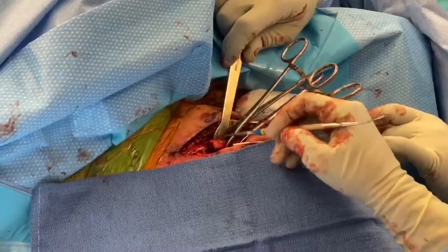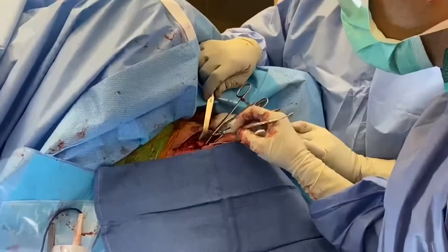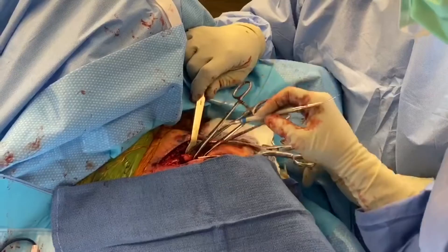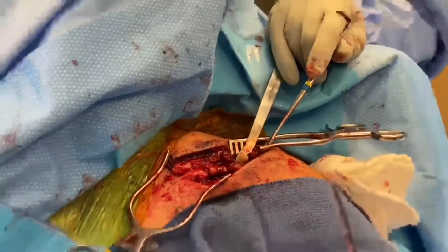Alright guys, so we reduced that butterfly — that free-floating butterfly piece. I've got it now reduced to the lateral aspect. I'm going to combine that by drilling and putting in a screw from front to back, perpendicular to the fracture plane, so hopefully we can make that one large segment and make it easier to fix onto the medial aspect of the shaft. We're going to go ahead and put a screw in there — we call that a lag screw. We put that lag screw in and secure that butterfly piece to the lateral side, and then we reduce that to the medial side.